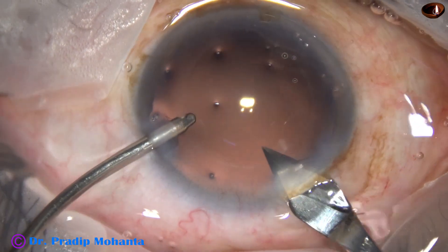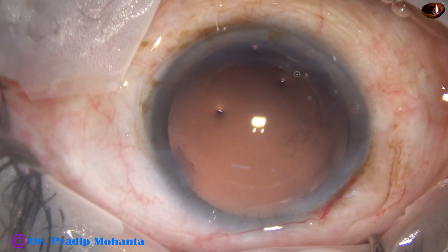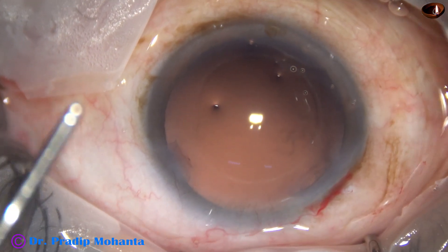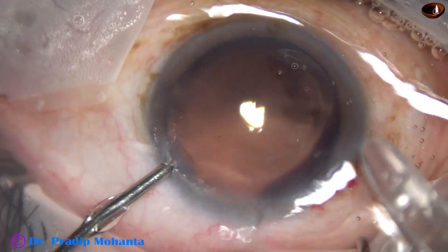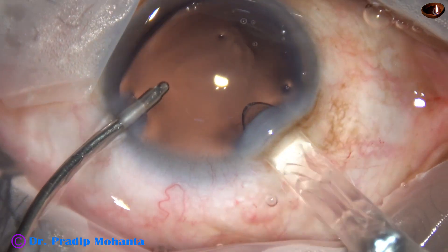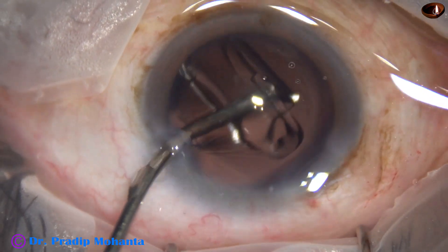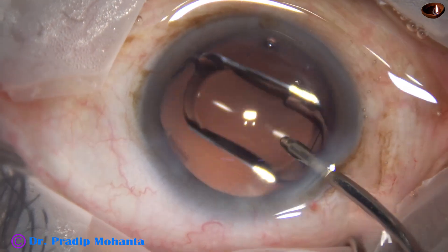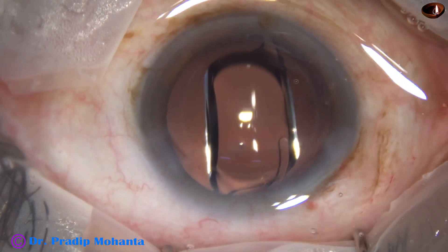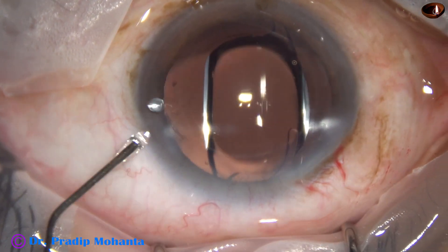Enlarging the main wound by 0.2 mm — the wound which was 2.8 mm is now 3 mm. And now here goes a hydrophobic acrylic single-piece monofocal aspheric intraocular lens. This is Tecnis One from Johnson & Johnson — a beautiful lens. I love this lens. Again, no financial interest.